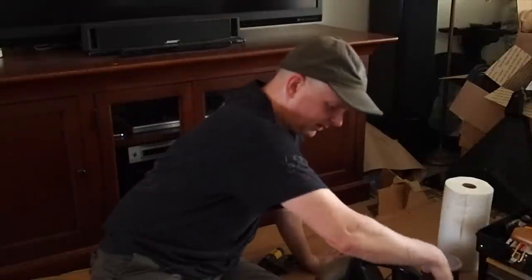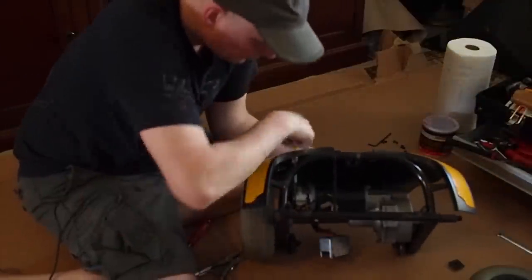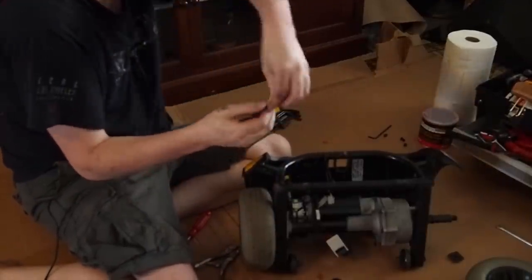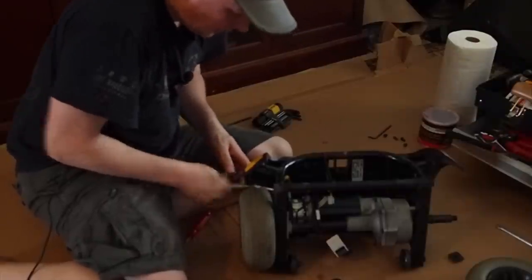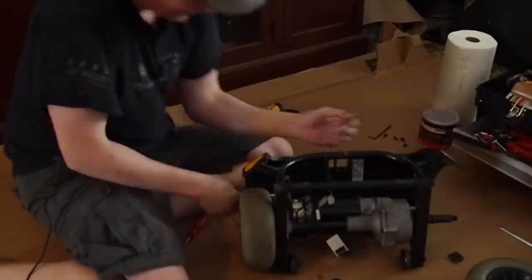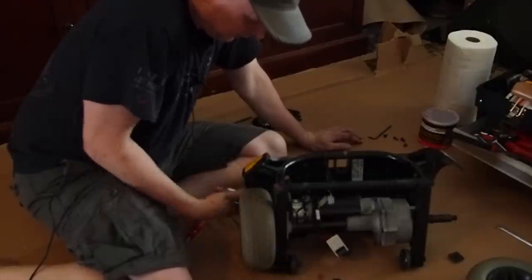All right, so all I have to do is take this clutch arm off, and I could pull this whole thing out of here. These screws that hold this lever on are really small. The small screw is threaded into this metal, and this nut really just locks the screw on. So you kind of have to take the, and I'm bad right now, I'm using some needle nose lock grips for taking these bolts off, but really you should use a wrench, but it's really hard to get in there. So I'm just using these.